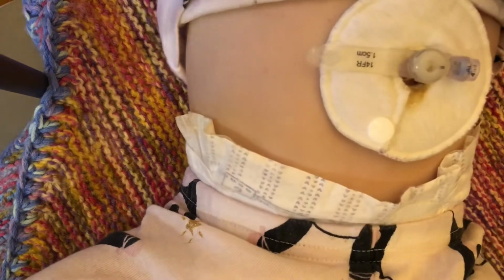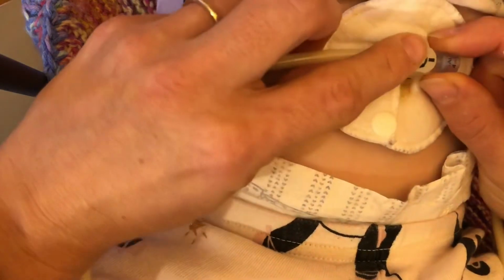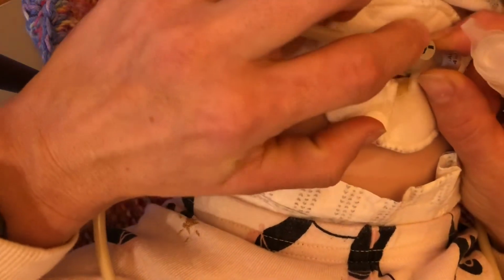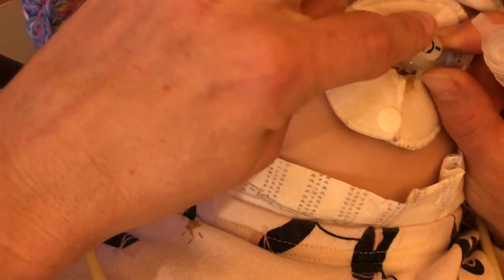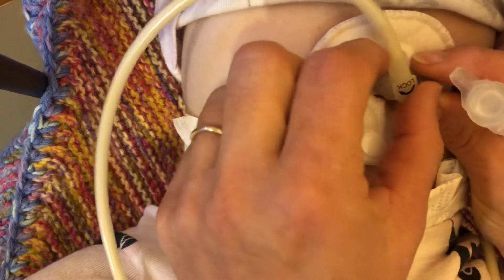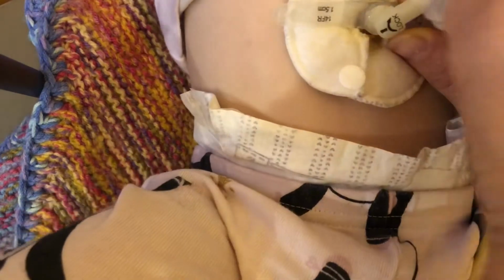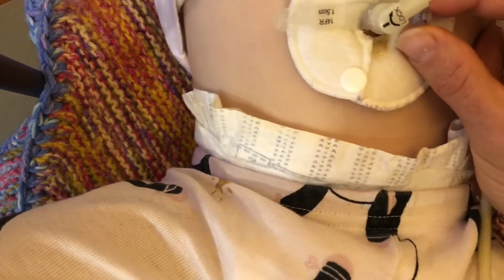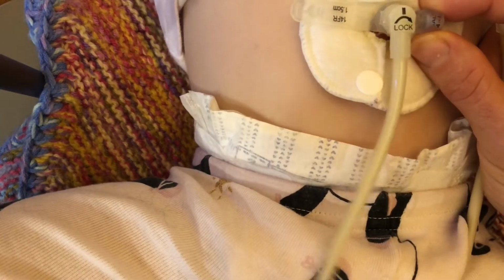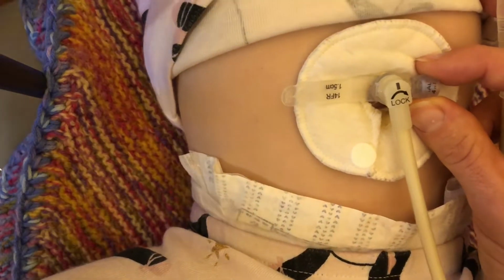What's that? Okay. So you have the lines lined up here, and you just stick it in. And when you do it, you have to push it down just a little bit. You can see it go in. And then once it's in there, it will allow you to turn it. Notice how I'm just holding this steady, Patricia, and then I'm just turning the actual feeding tube, not her little button. Just turning that tube there so that you can see it, so that it's connected.